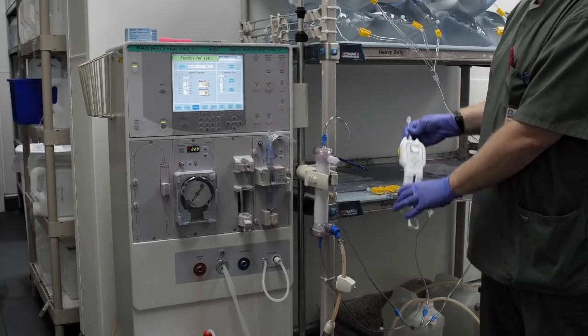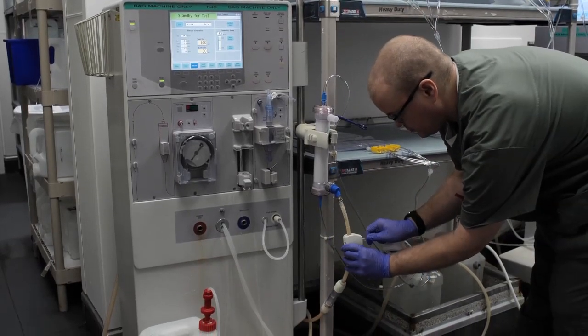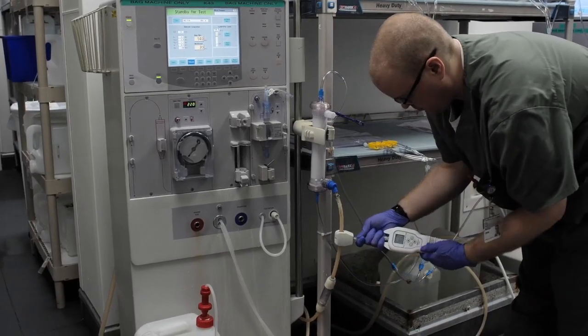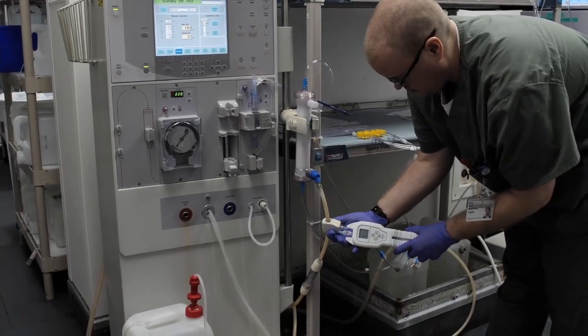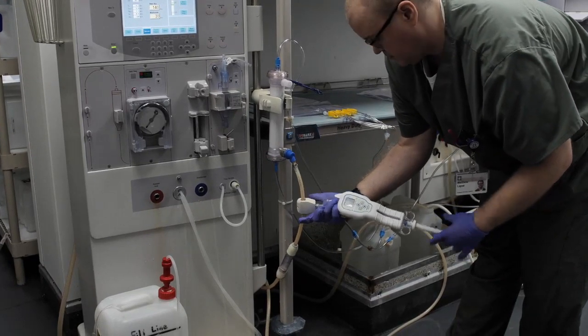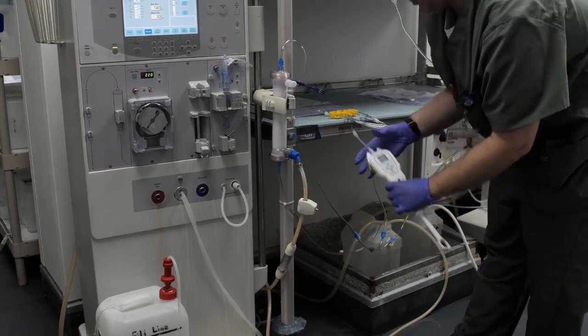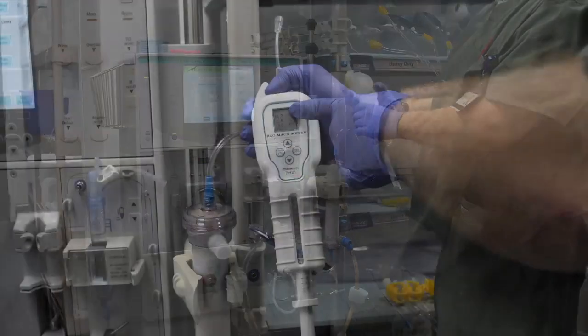Step 15: Then verify conductivity using the Phoenix meter. Do this by collecting a sample of the fluid coming out of the venous line, then sample with the Phoenix meter and ensure the pH and conductivity are in the acceptable range.